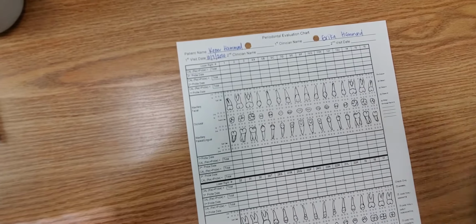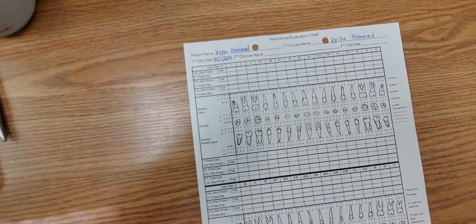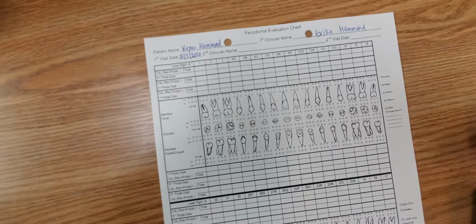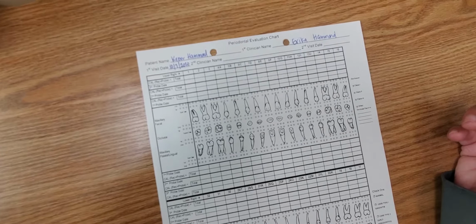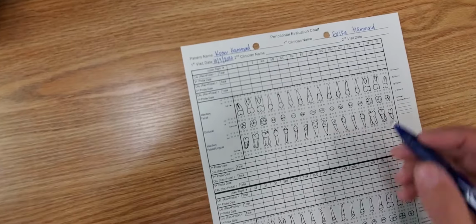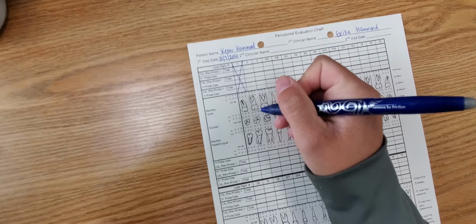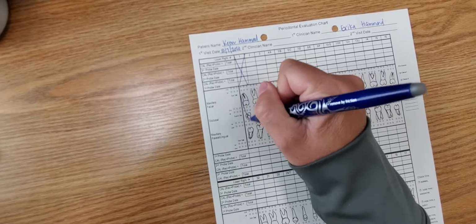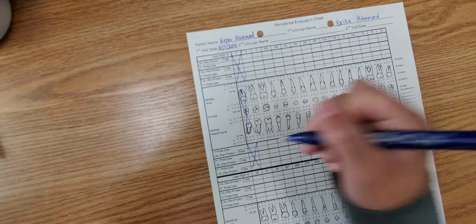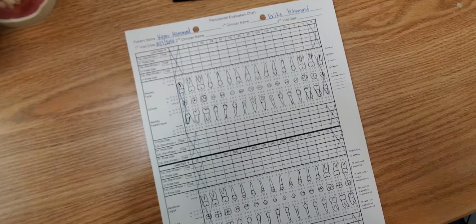The next thing you're going to do is make sure that you cross out any missing teeth. If you have missing teeth and you leave them in, it's going to make you get off in your charting. Sometimes patients have missing wisdom teeth, so if they do, you're going to cross off the teeth by placing an X through the boxes, the tooth, buccal, and lingual boxes. You could do that on all of the wisdom teeth.